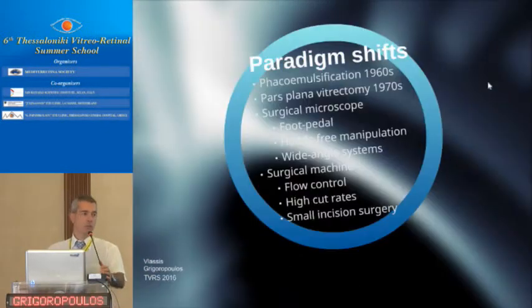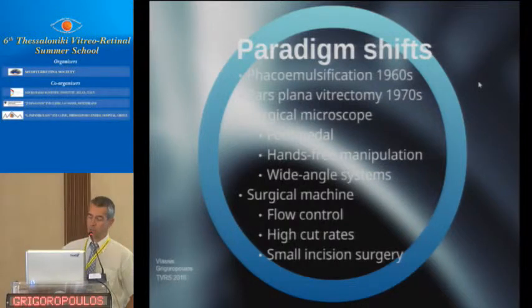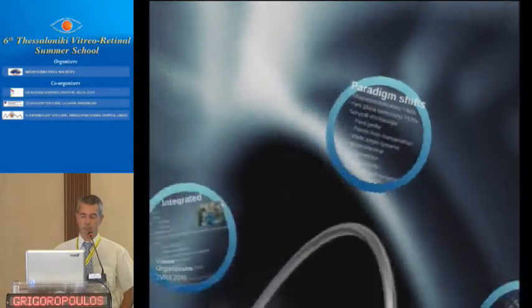you are all aware of all the evolution and all the advancements in ophthalmology over the last years. Phaco in the 60s, pars plana vitrectomy in the 70s, surgical microscope, we're using the foot pedal, hands-free manipulation, wide-angle systems that helped us a lot to do a better and safer surgery. And as far as the surgical machine is concerned, the flow control, which is very important, the high cut rates, and the small incision surgery.